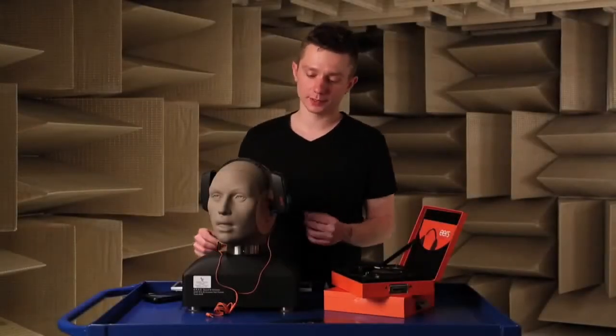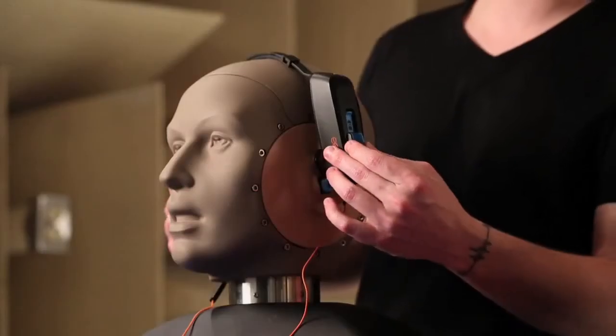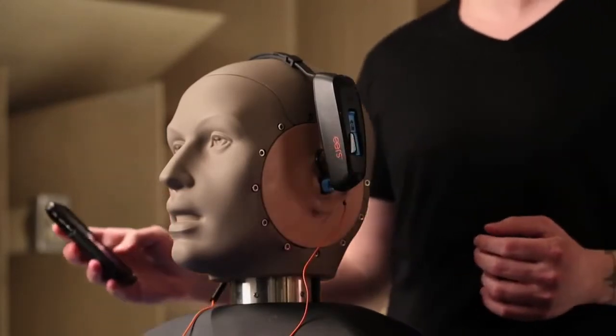To activate the fitting system, squeeze the tab on each side until you hear it click, and then activate your five-minute timer.